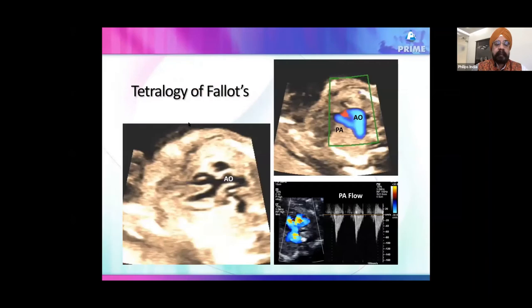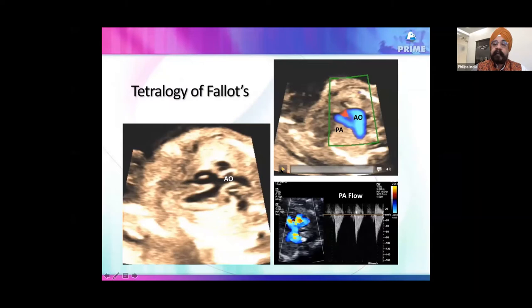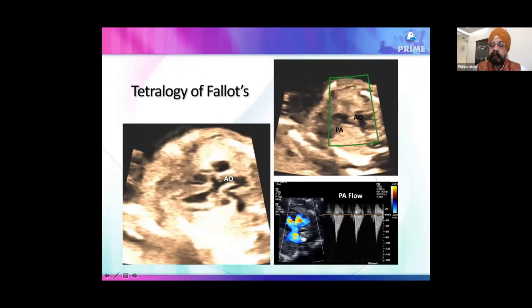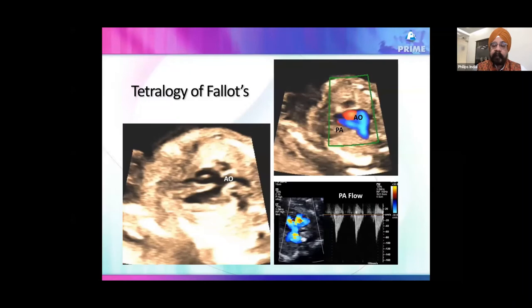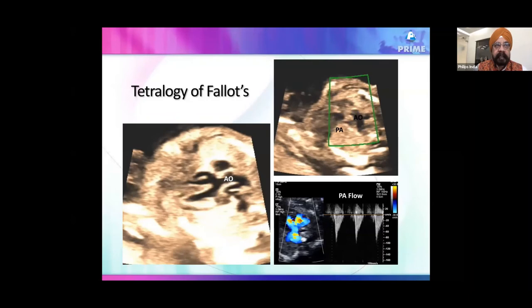In tetralogy of Fallot, you can see the LV, RV, overriding aorta, and a large VSD in the fetal echo. The pulmonary artery is small, but you see little gradient — barely over 1 meter per second velocity. The diagnosis of pulmonary stenosis in tetralogy of Fallot is made by the size of the pulmonary artery, not the gradient.